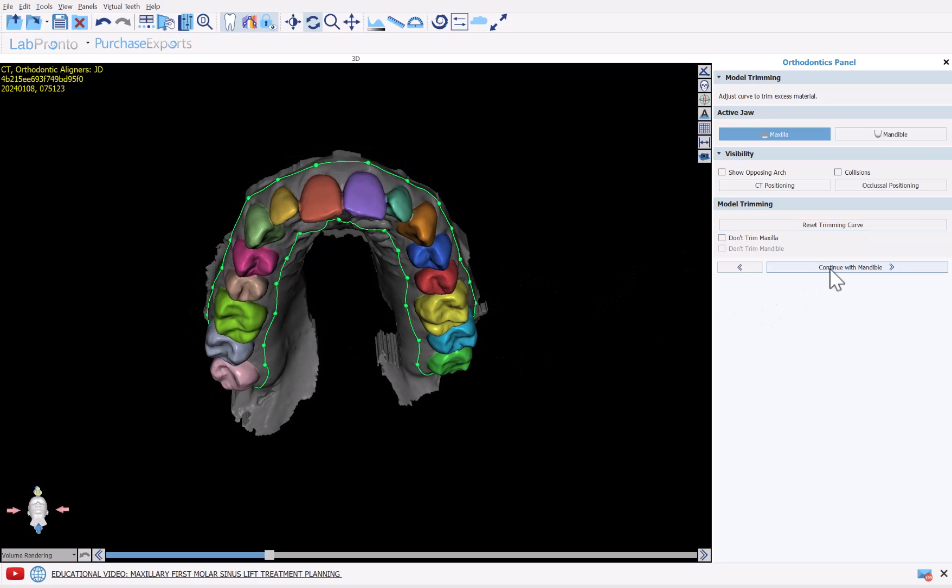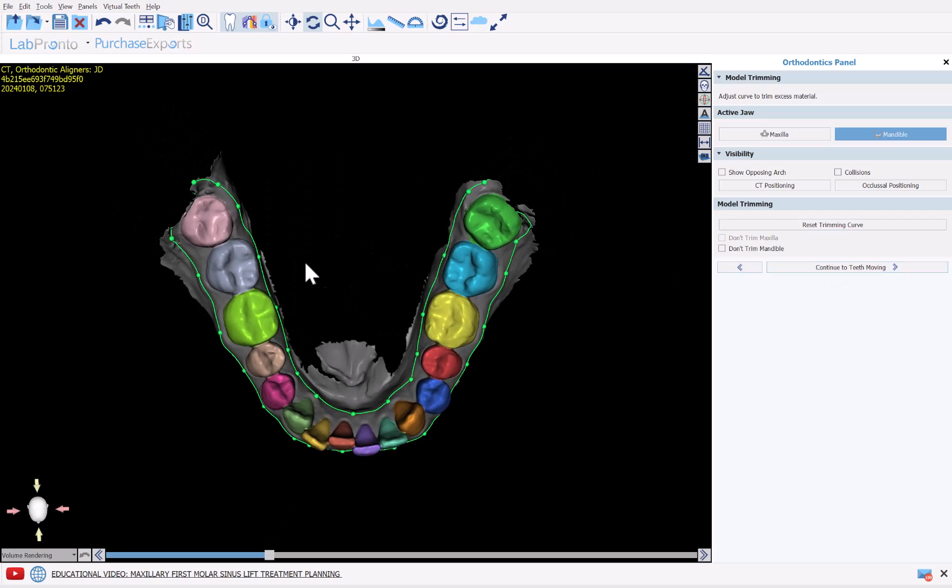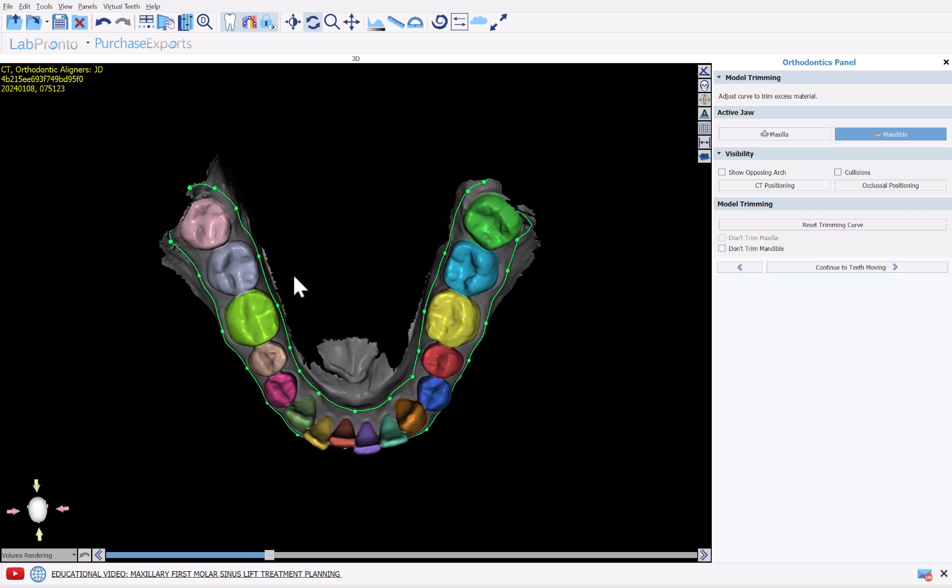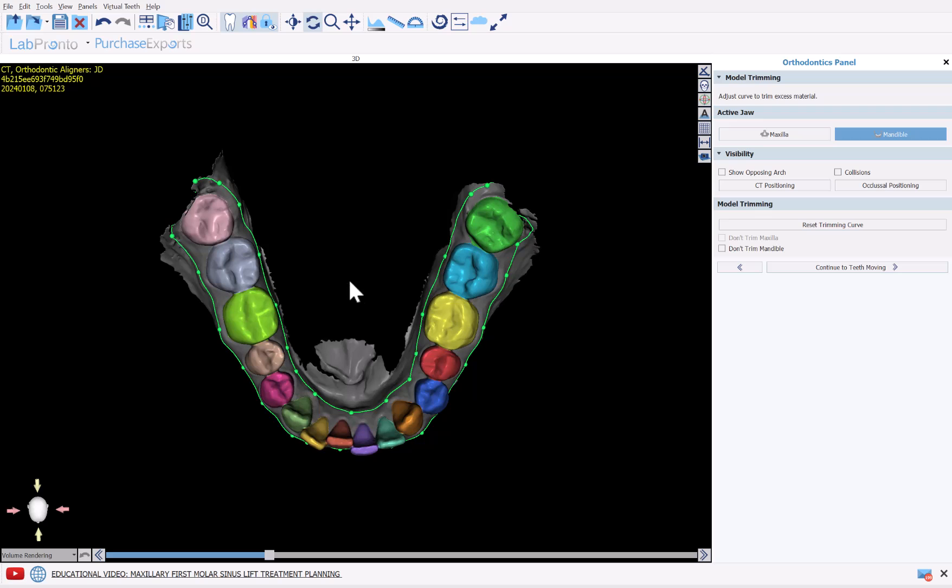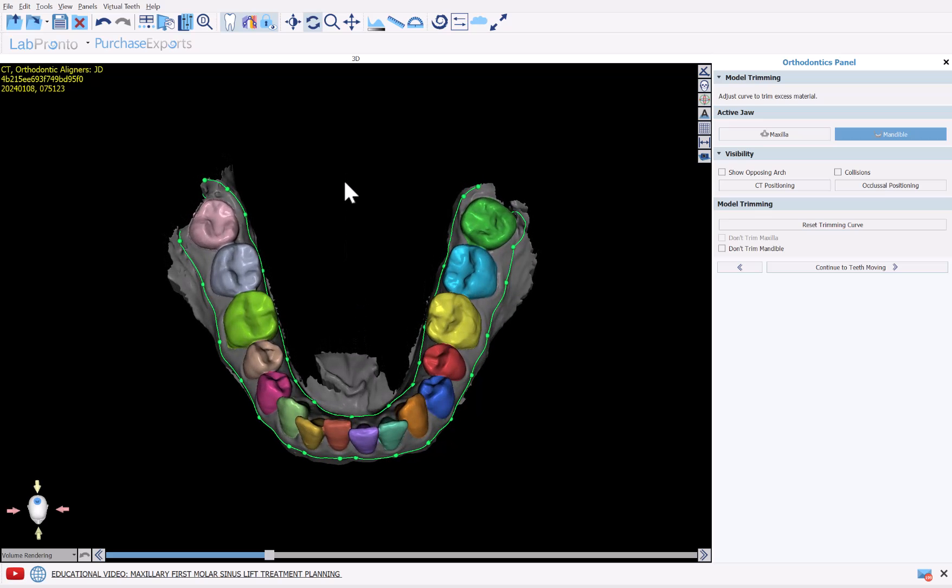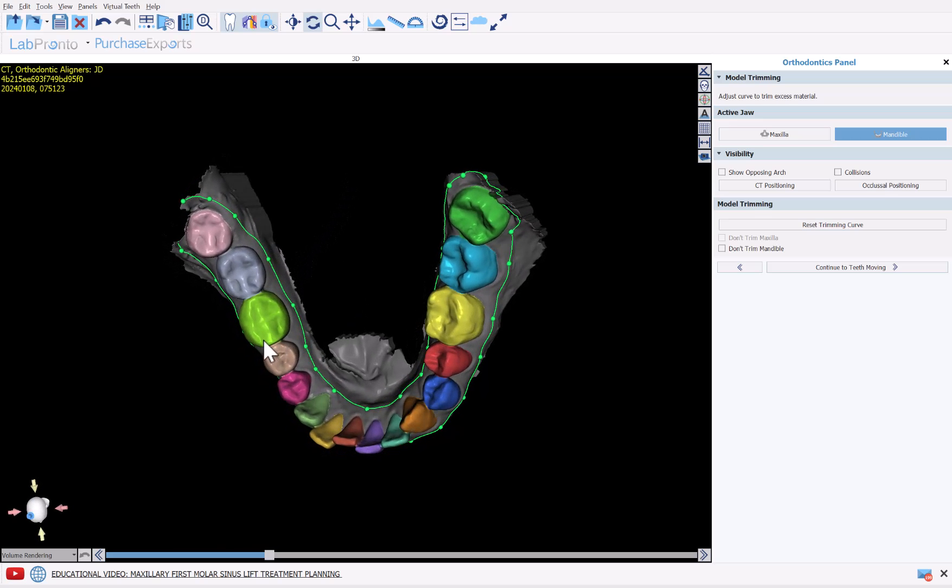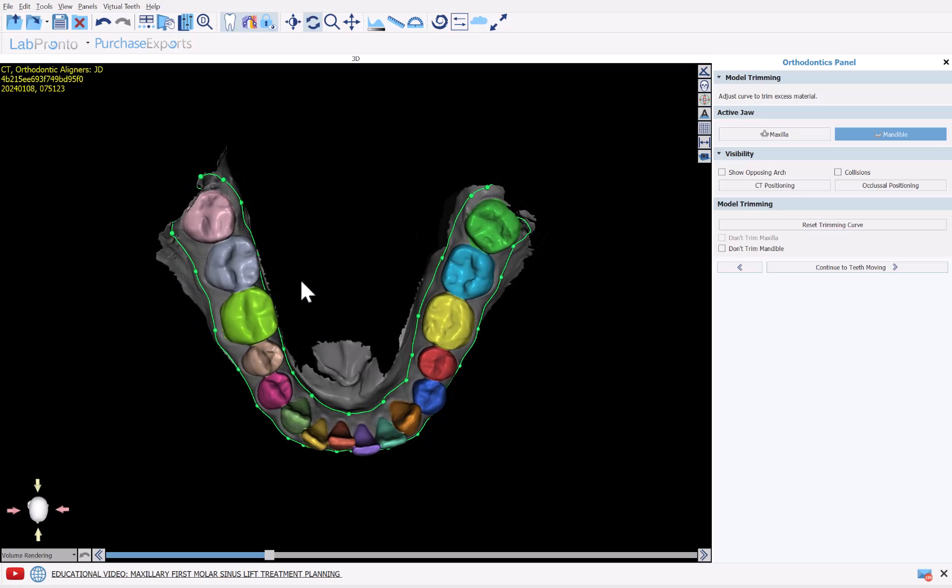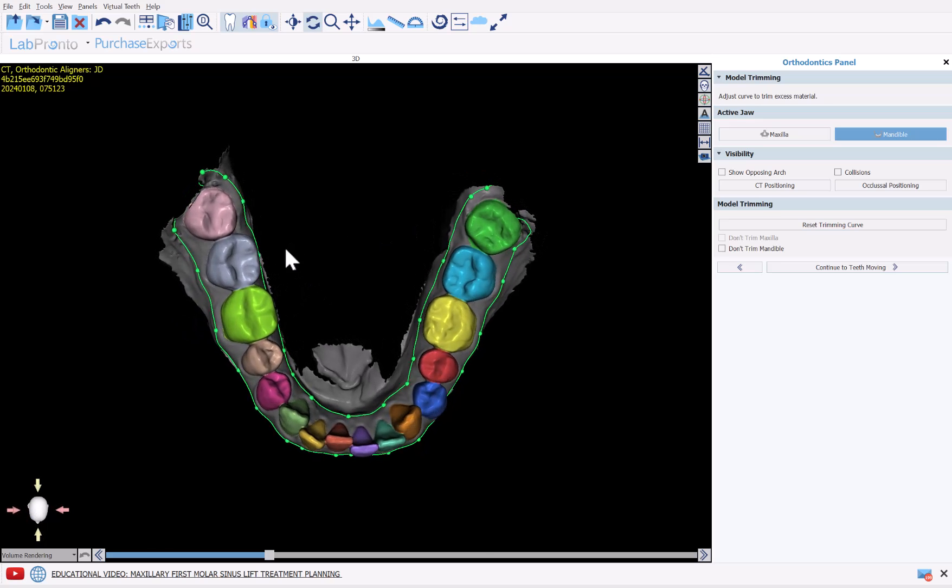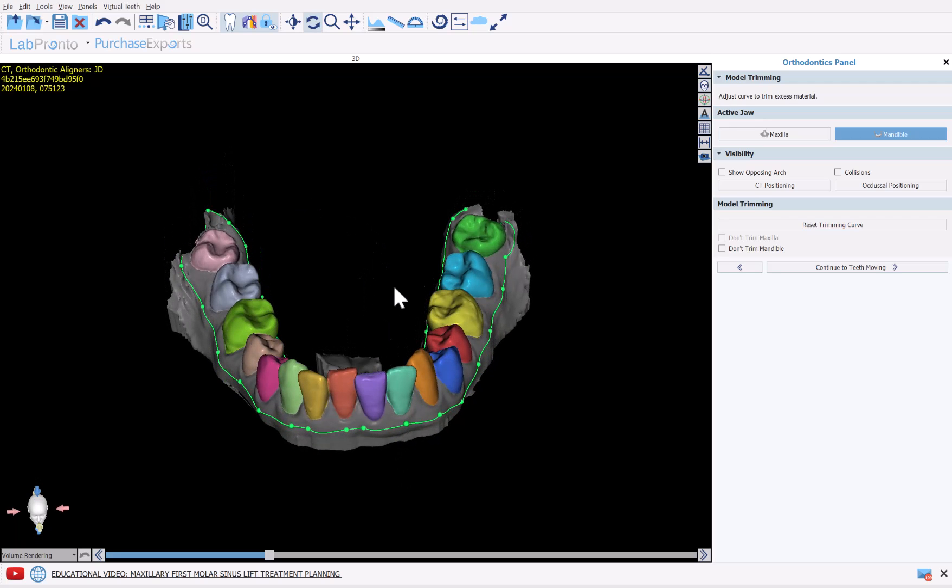But once the curve has been confirmed, just click Continue with Mandible. Now we have the mandibular jaw. The curve is placed automatically. You don't really need to worry if the curve runs off the heels of the model. That's fine. It'll just be cut away up until that point. Once you've confirmed the curve, click Continue to Teeth Moving.